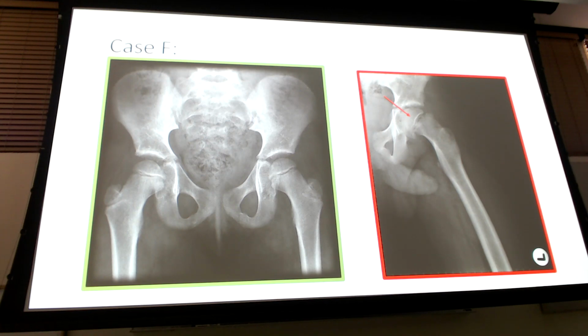Now, you may not even have to wait till then, because likely what's going to happen is you're going to order the x-ray, it looks normal to you because we look at Radiopaedia, I got you. It's pretty normal, but then we have a pediatric radiologist who is good at looking at these things. They're probably going to go, hey, we're noticing a Salter-Harris 1, we see the skiffy, here's why. And then you just have to call back and go, hey, I did that wet read, it looked good to me, but our pediatric expert looked at the x-ray, they actually did find this, so now we're going to get you to ortho for care. So you really don't have to worry about missing something like this too often, as long as you order the x-ray, because your pediatric radiologist will likely find it on their report.